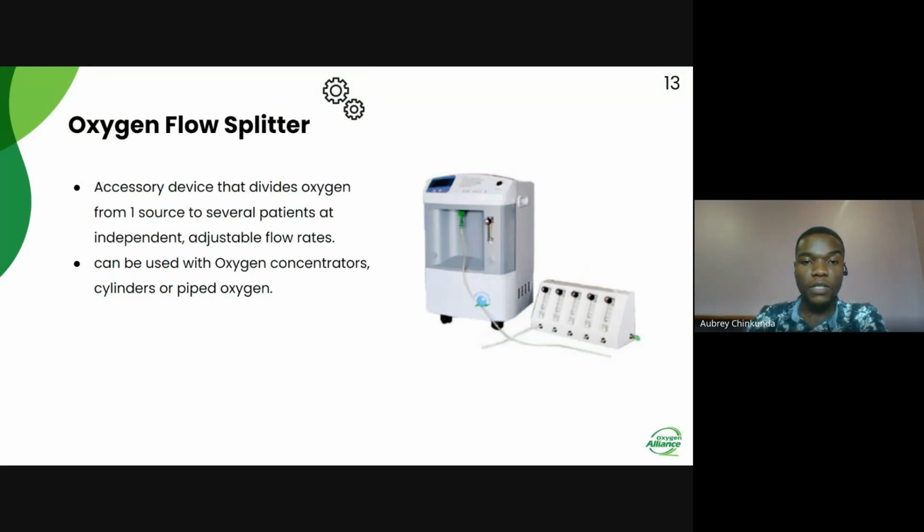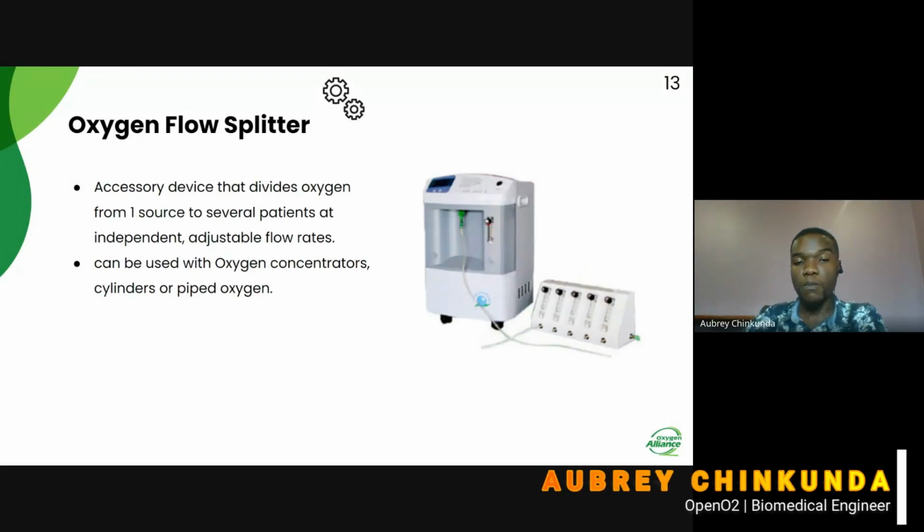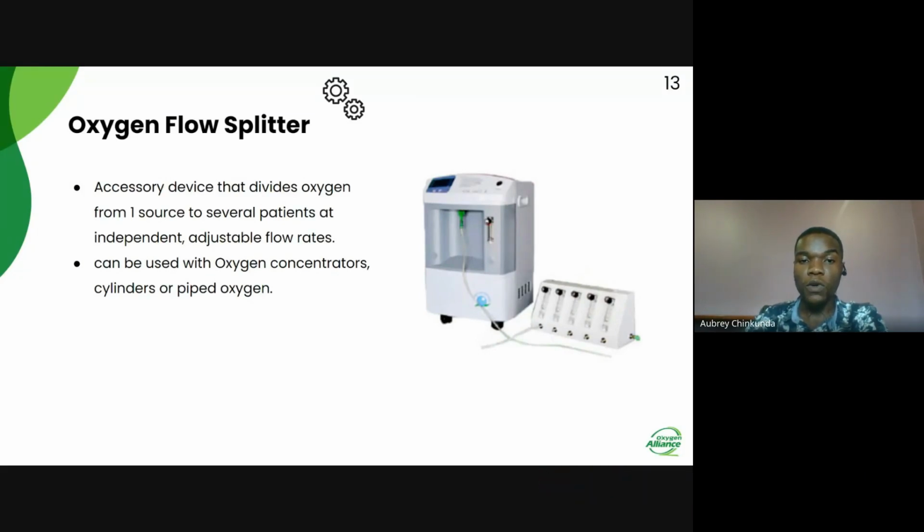So the setting on the oxygen concentrator needs to be 3 liters per minute, because they're saying that it should always be at least 1 liter per minute more. So that is to ensure that if there are any discrepancies in the flow, that 1 liter per minute that you've set will give you that cushion and ensure that the required flow is still delivered to the patient.